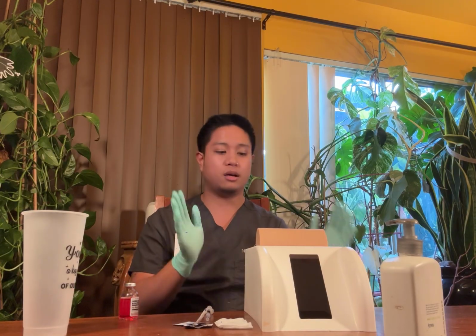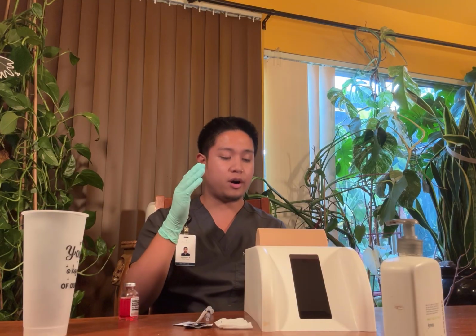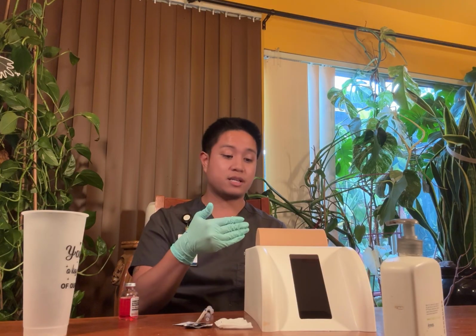Now I can move on to assessing for a proper injection site. So now we're going to look at the patient. We're going to have them lay on the left side, where their right hip is facing towards me and exposed. Now we're going to locate the site using some anatomical landmarks.